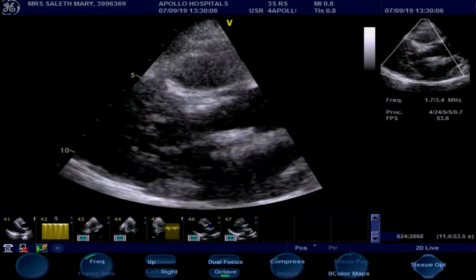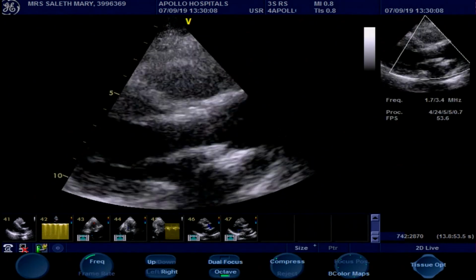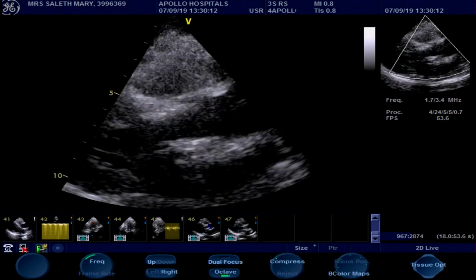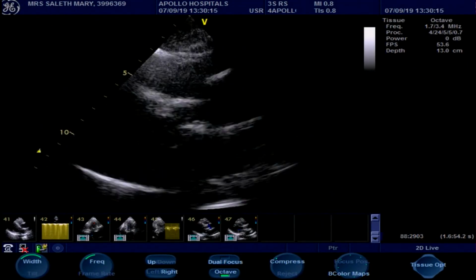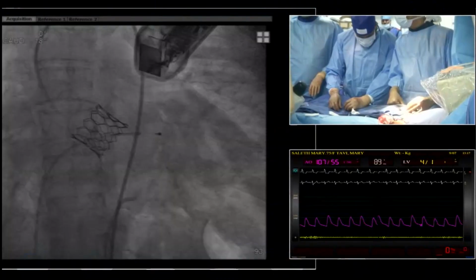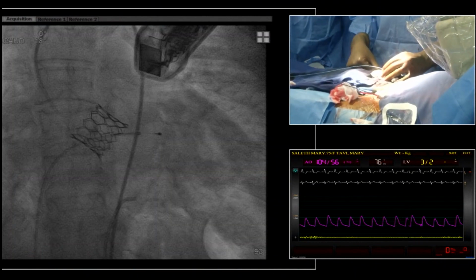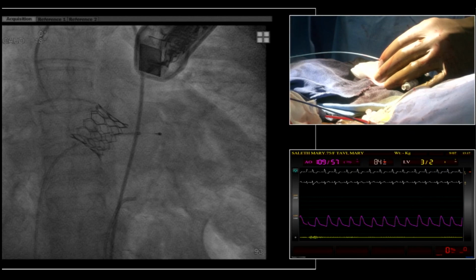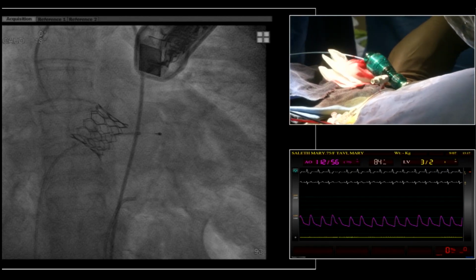Could you switch to the angiogram? So if we could bring the camera in on the groin now, please, for the closure. Okay. So, Sengo, can you explain your strategy when you close the vessel? Do you give some protamine to the patient or not? What is your strategy?